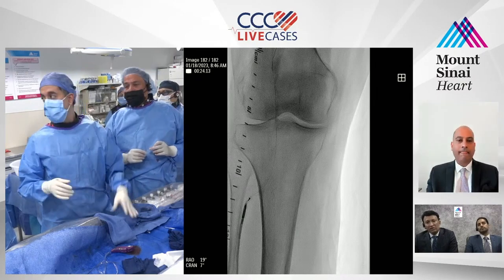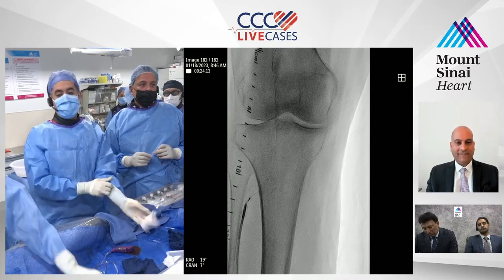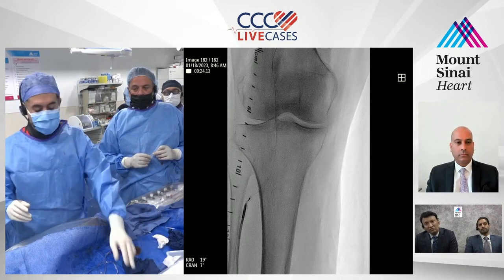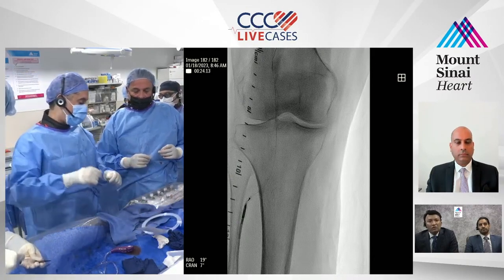3-0 80 balloon, guys? I think it's more of a lesion than here, I think. Yeah, there's calcification right there as well. You can see, of course, not as dense, but definitely there. Watch it. All right, so we're going to go.